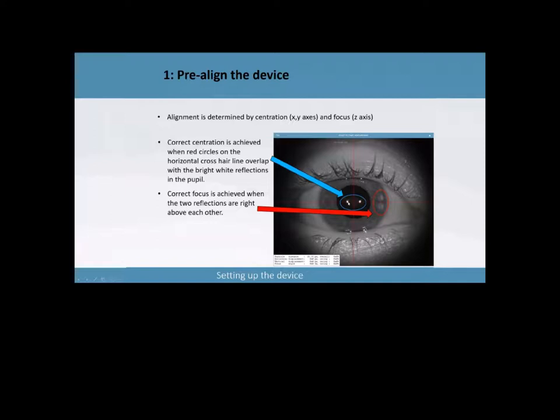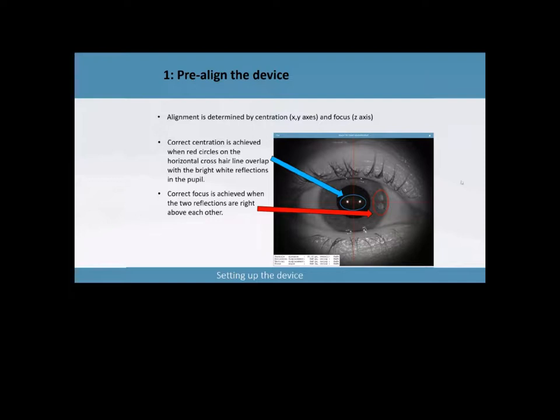So if you've got the two aligned here in the middle, you've got the center of the eye and you're going to get a nice centered image. The other thing you want to do is there are two vertical reflections up here. You want to make sure those are aligned in a vertical straight line. If they're not aligned, it means that you're either too close or too far away of the eye, which is going to end up in not a very accurate measurement.